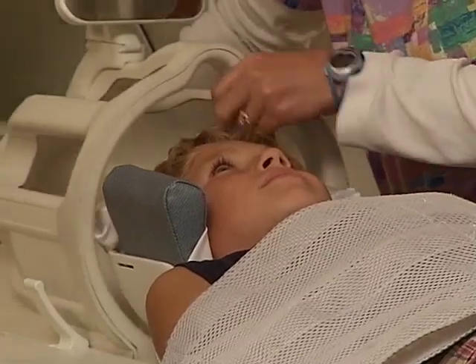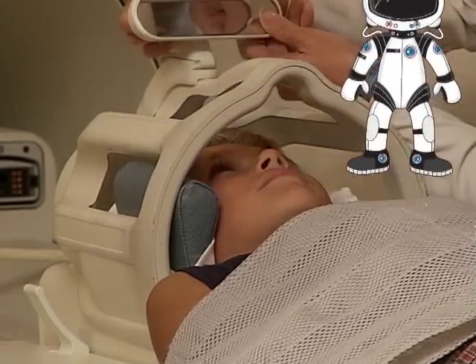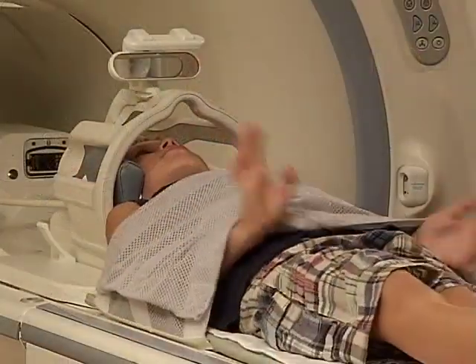It feels just like a football helmet or the type of helmet an astronaut wears. Just like an astronaut's helmet, this helmet is special — it has a mirror attached to it so you can see your family member at the end of the bed while you're getting your pictures taken.